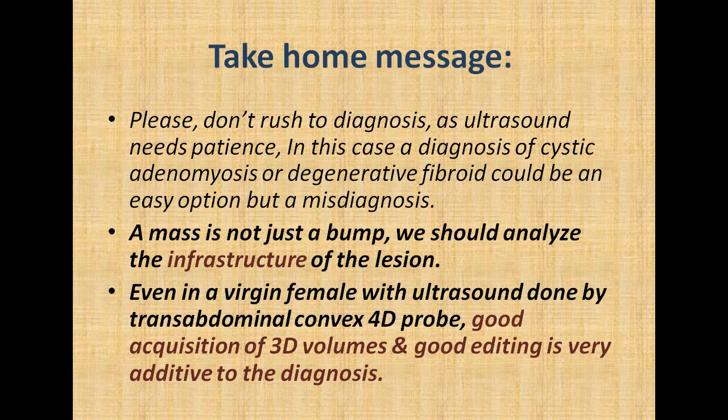Even in a virgin female, with ultrasound done by a transabdominal convex 4D probe, good acquisition of 3D volumes and good editing is very additive to the diagnosis.